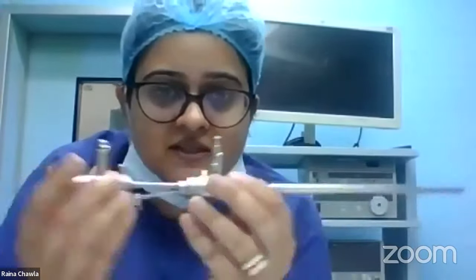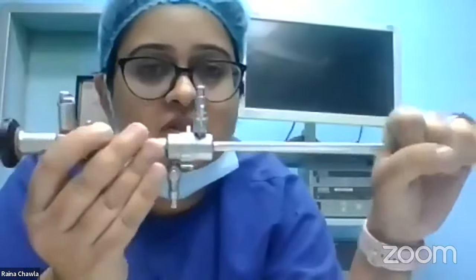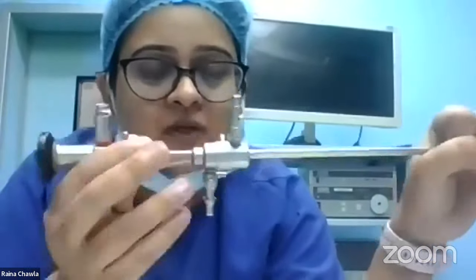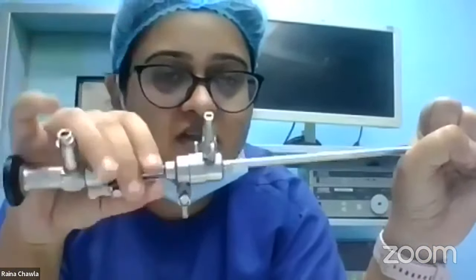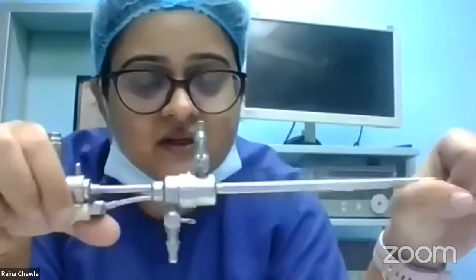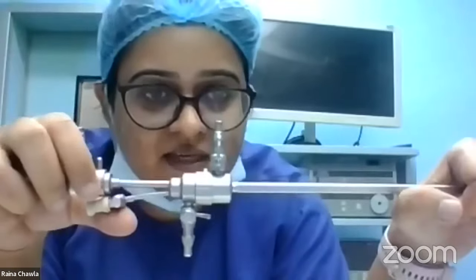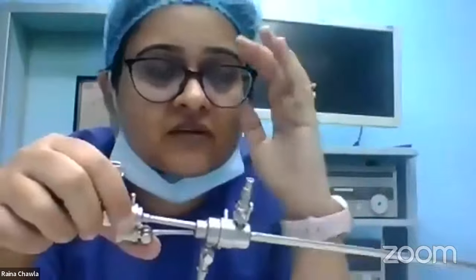In laparoscopy you have different ports for different surgeries. Here we have a single opening. The uterus has only one opening, so everything has to go through here, through the cervix. This whole channel goes through here. Now, this is basically through which my fluid will enter and exit. Here we don't use gaseous distension media, we use a liquid distension media. We usually use normal saline, or we use glycine or mannitol. These are the distending media we usually use.